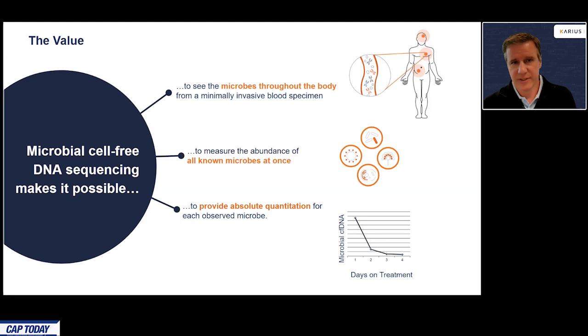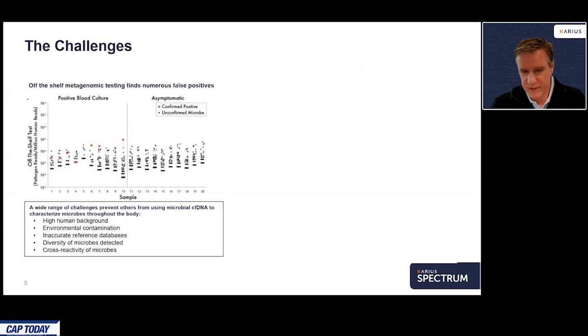And so, this slide summarizes the value, very analogous in many cases to the value we've seen in other cell-free DNA-based diagnostic applications. But I also want to double click on the challenges that become just as obvious as the value as soon as you dive into actually doing this. And so this image represents one of the first experiments that we did to assess off-the-shelf capabilities of the best available laboratory kits for extracting microbial cell-free DNA and converting it into libraries, as well as the best available compute pipelines for analyzing that data.